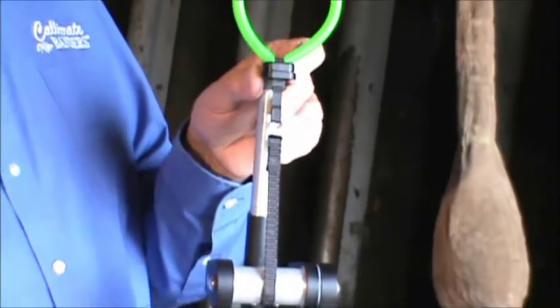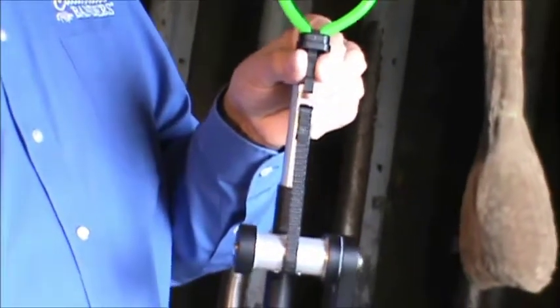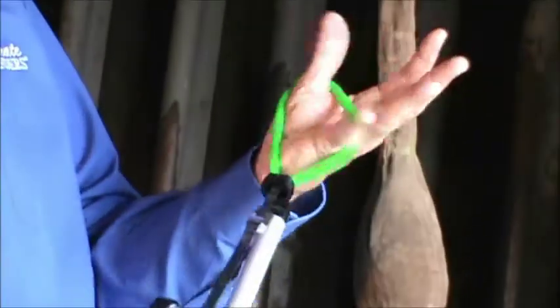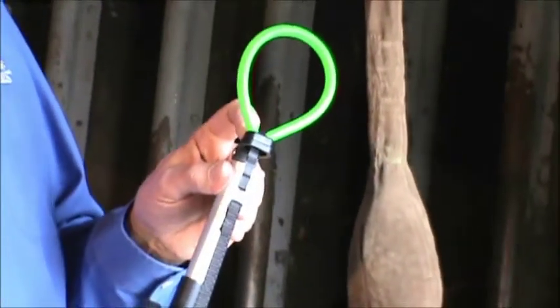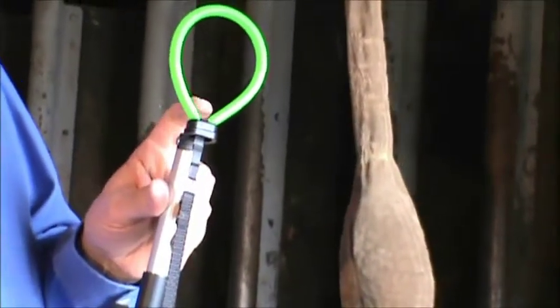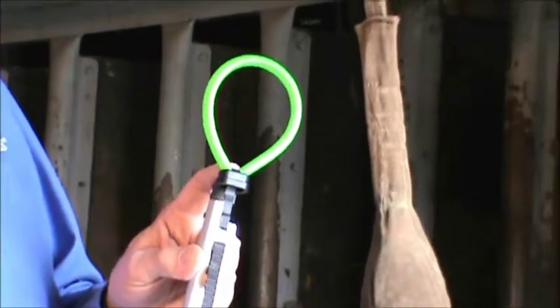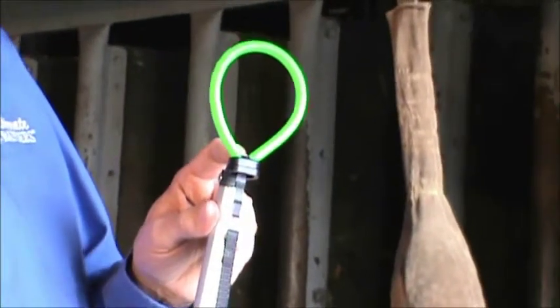This is very important: do not pull this loop through the nose of the tool. Doing so will cause problems because when you apply the loop to the animal and you're stretching it and trying to get it over the testicles, this plastic clip can become disengaged from the nose. You may not notice that, and then when you tension the loop and release it from the tool, this plastic clip won't lock the loop in place — you'll have to start all over. The plastic clip has to stay engaged on the nose of the tool up to the end of the process.